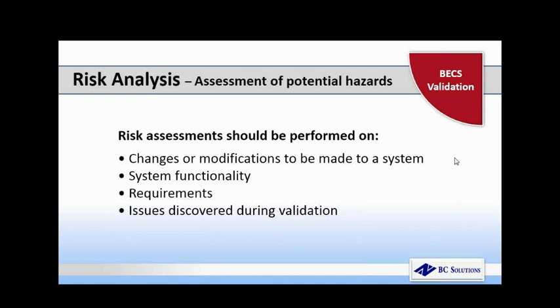A validation after you've done your risk assessment. So that would help you determine your decision on what validation you're going to do, how you're going to do it, how much you're going to do. Before you begin an actual validation, you should perform a risk assessment on the system functionality and the requirements that you're going to use in your validation.